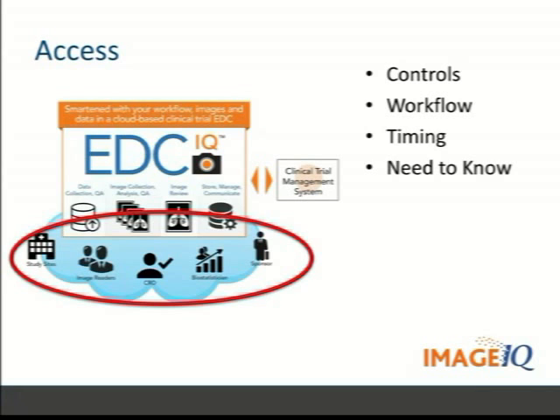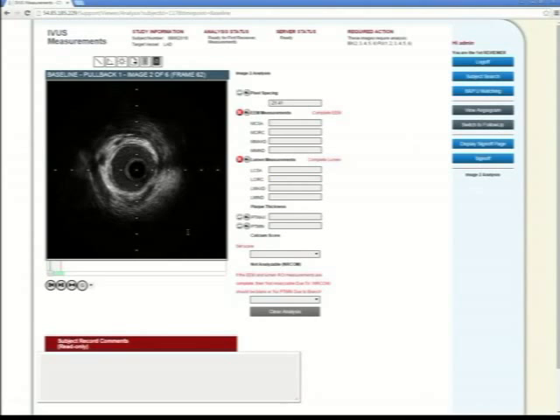That's exactly right. And so with our process that we've incorporated in the lab, we have a multi-review process for all our imaging. Our first reviewer, which you saw what I was doing just now, performs the matching and the analysis and all of that. And then they'll sign off on the entire case.